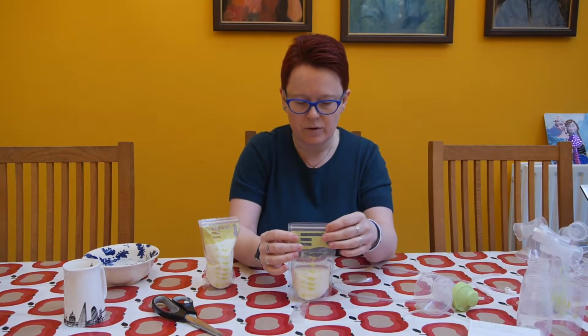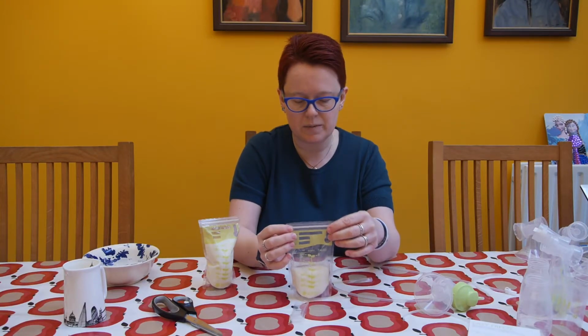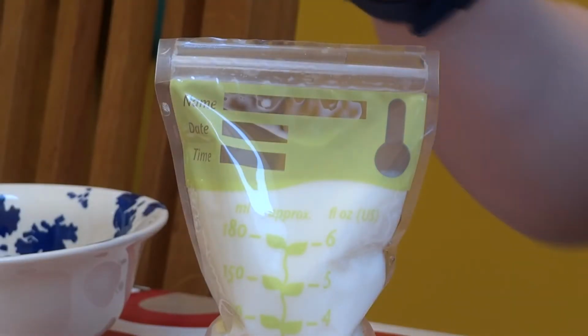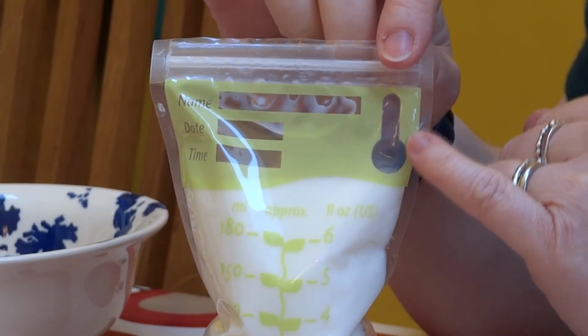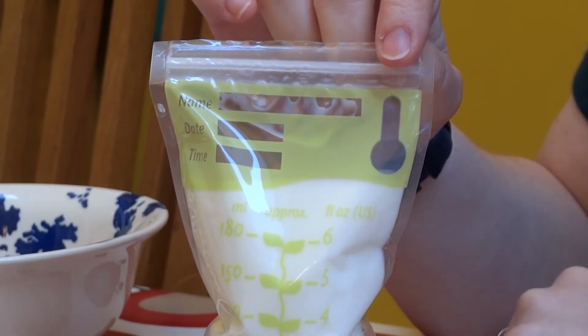Length of time depends on the temperature of your freezer. Quite often it's going to be 6 to 12 months if your freezer is below -18 degrees Celsius. And I also want to draw your attention to this little temperature gauge here, which is very useful because it's going to tell us when we're reheating the milk whether the milk is the correct temperature for baby.